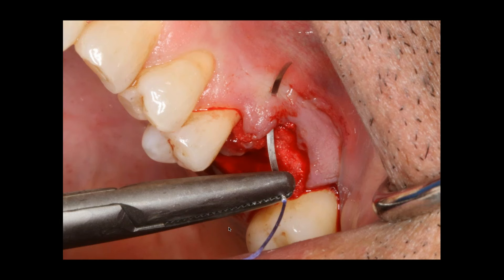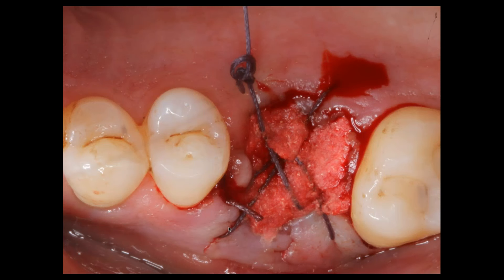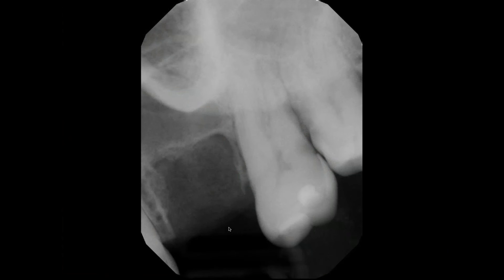I'll just put a couple of simple interrupted sutures. I'm taking my needle, which is a reverse cutting needle, from the crest, and I'm actually penetrating through the facial tissue — thus eliminating grabbing onto the graft material. I'm going to turn the needle around and do the same thing, going from the crest of the socket to the palatal, and simply do some cross-sutures to maintain that graft material into the site. You can see it's radiolucent immediately after extraction.